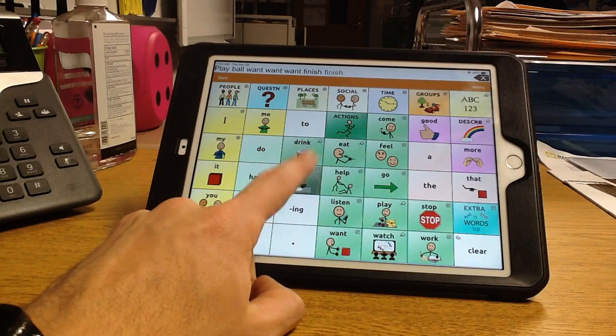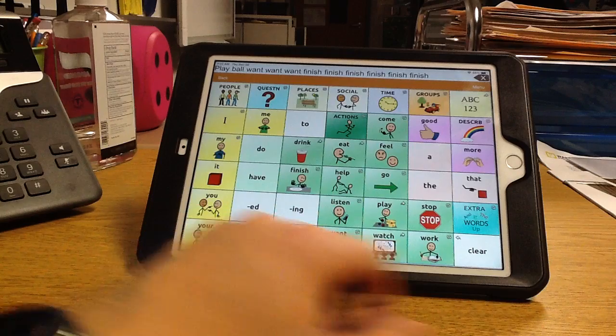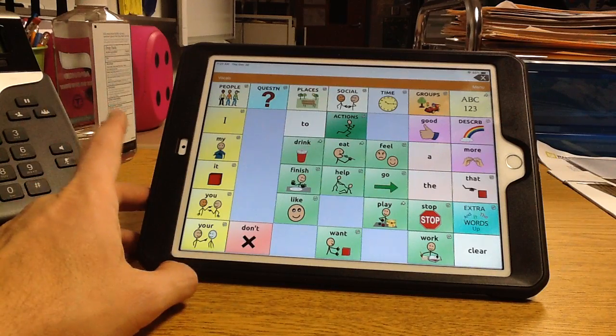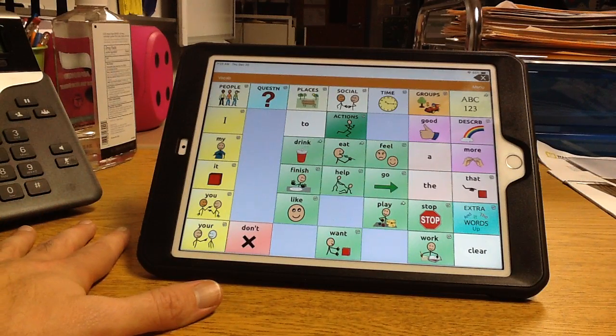Sometimes he will just tap over and over and over, and we want to discourage that type of behavior. Convince him to clear it and start over fresh. So if he gets confused or off track, we just try to take it home to a nice, clear beginning.